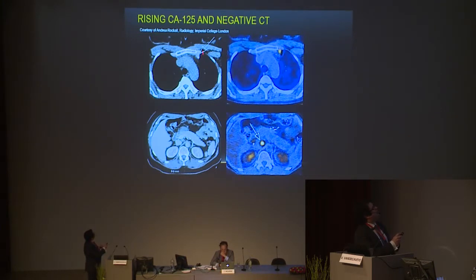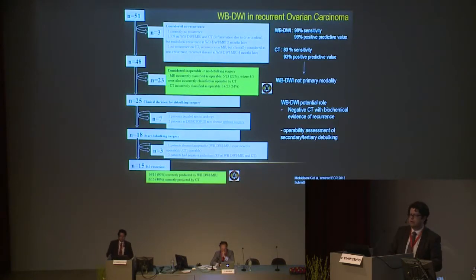Well, we had to learn it as a radiologist from our colleagues from nuclear medicine. We had to look to this mammary chain. A lot of radiologists forget it. And talk to your radiologist, because often they need to be reminded what are the patterns of disease spread. But look, you can see clearly the bright lymph node. They said here this node was negative. I would not agree personally with such a round lymph node, but you can see nicely the bright spot of FDG uptake on the PET.